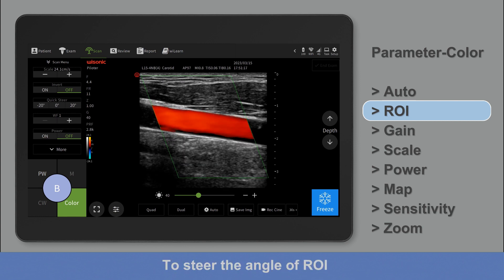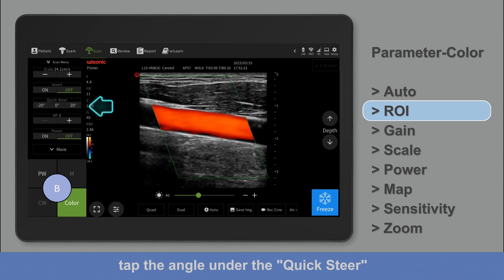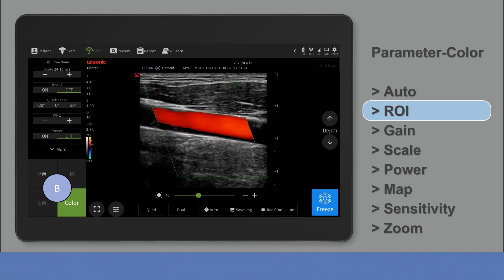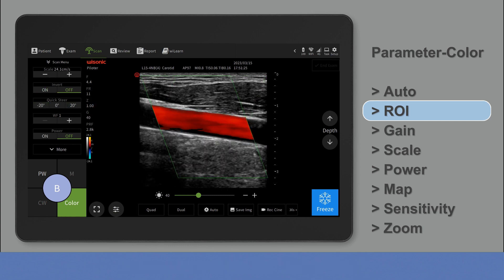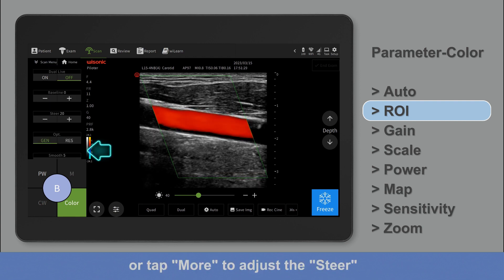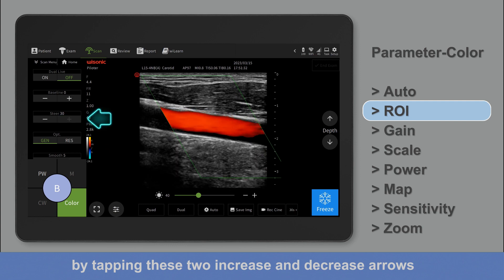To steer the angle of the region of interest, tap the angle under the quick steer. Or tap more to adjust the steer by tapping the increase and decrease arrows.